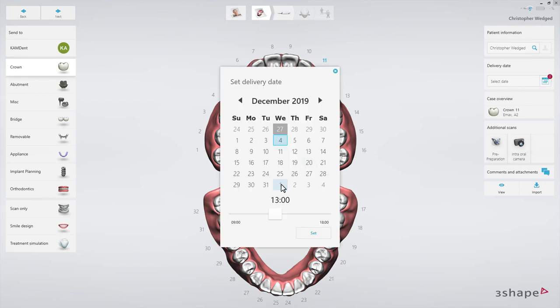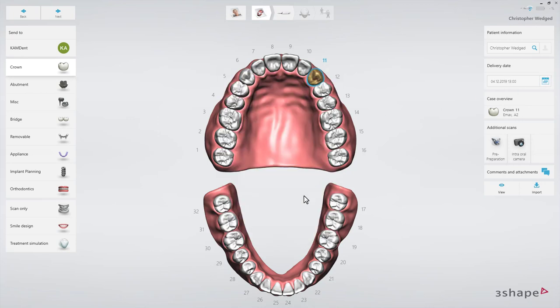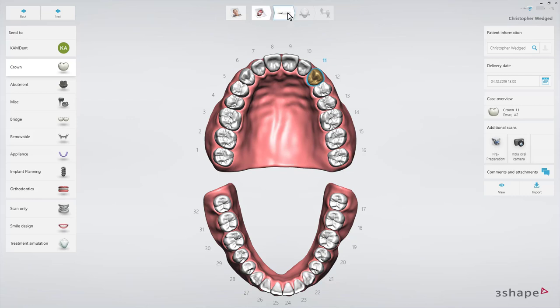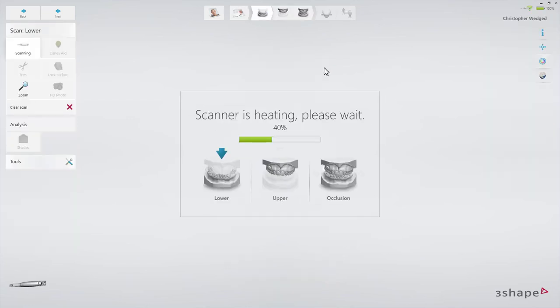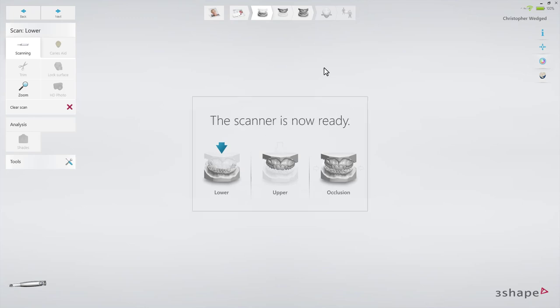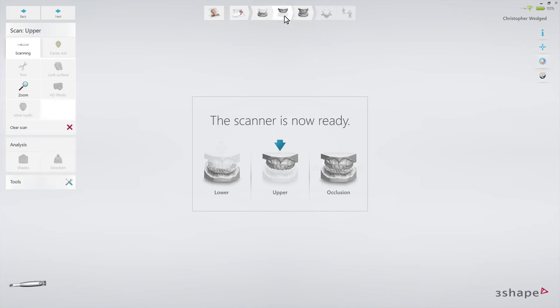When your order is ready, proceed to the scan page and make scans using the recommended scan strategies. For the purposes of this video, only the upper scan will be made, where the restoration is. In order to do that, select the upper arch in the workflow bar.